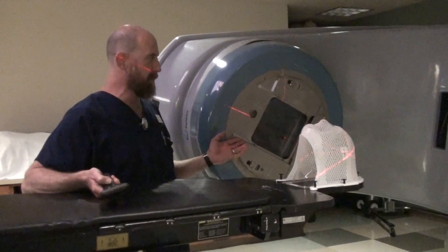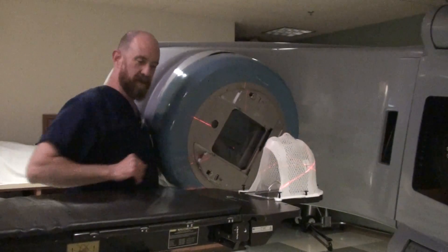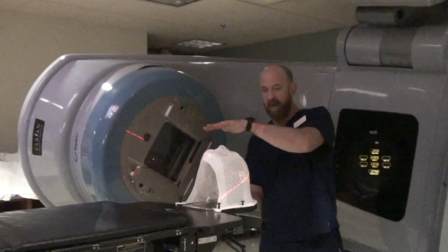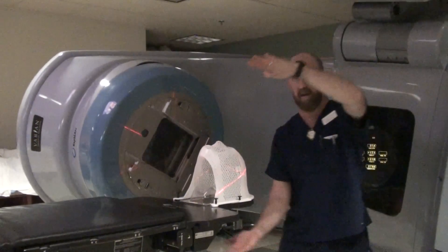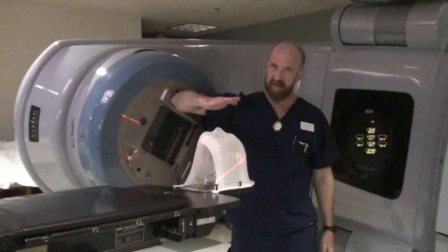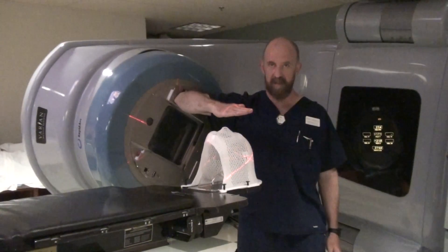We'll use 10 degrees because it looks like less of a lateral position. So what happens when you do this? With parallel opposed fields, you have divergence going evenly away from the gantry. If you rotate the gantry up, it actually bends this divergence on the anterior surface — the anterior part of the field — down.